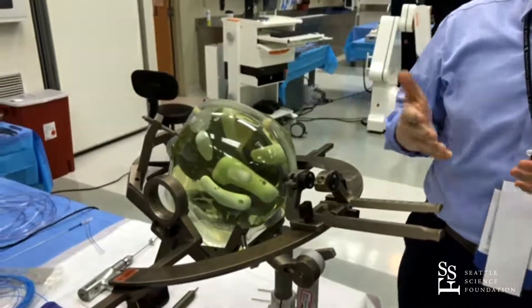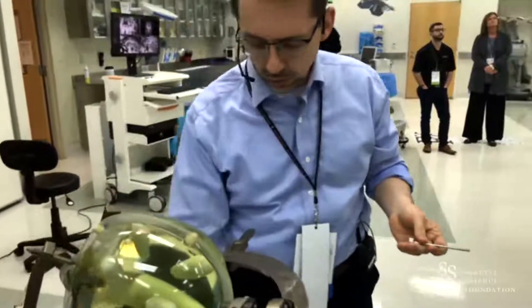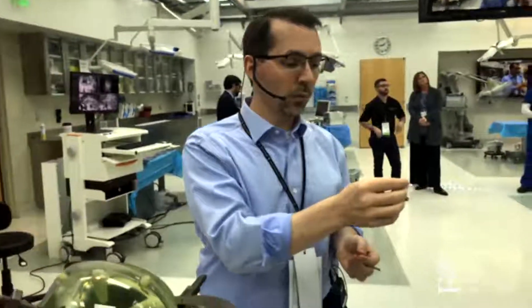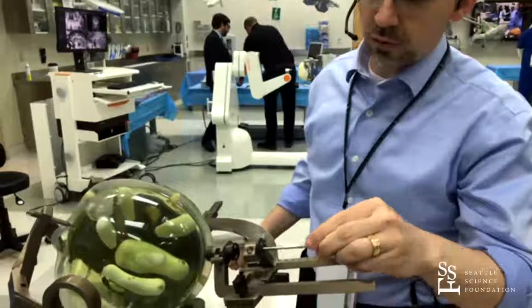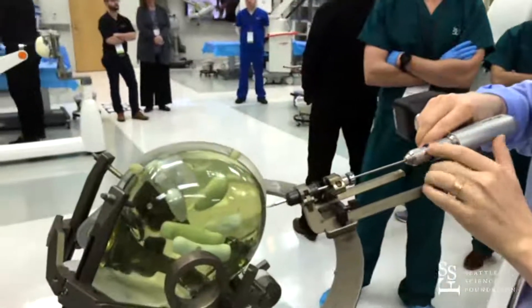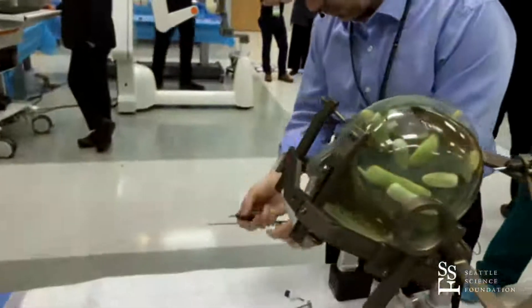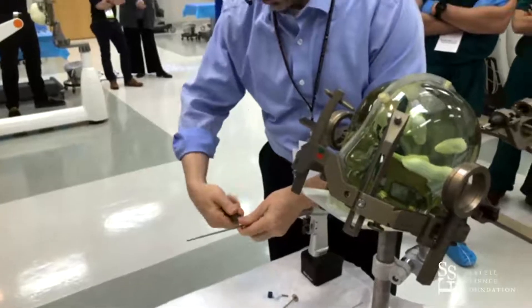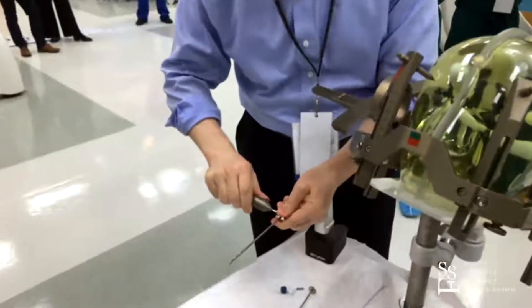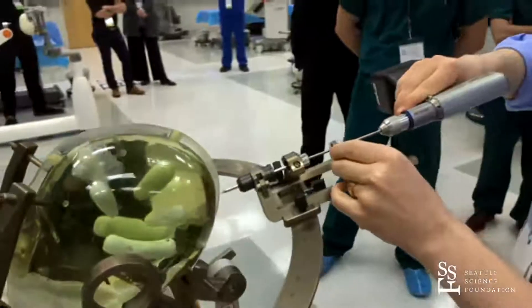Assuming this is all set up for the trajectory that we like — what we require is a reducing cannula that fits the drill for Visual Ace. It's going to ultimately require a 3.2 millimeter twist drill hole that the bolt holding the Visual Ace probe will fit. This has a reducing cannula that we can use under stereotactic control to drill a hole through the skull. There's a depth guard to avoid skiving and going too deep, since we just want to drill through the bone and possibly the dura, but not into the brain. That can be measured out ahead of time on the navigation workstation.